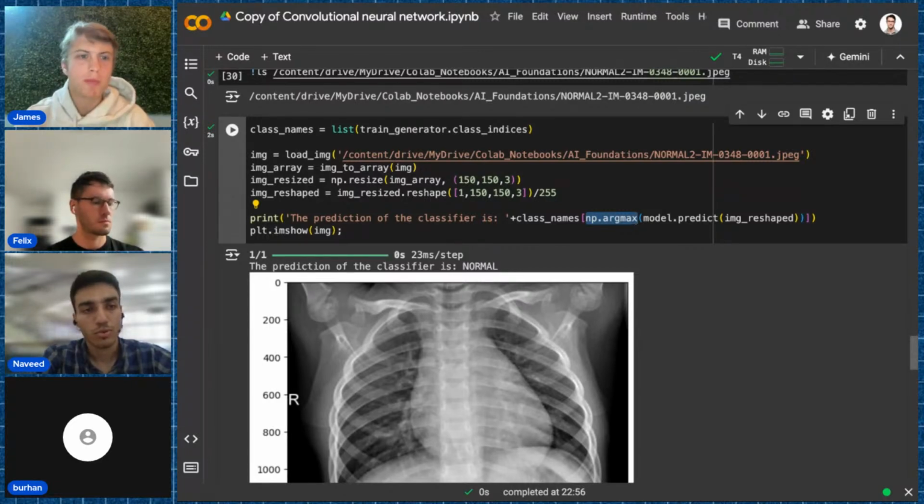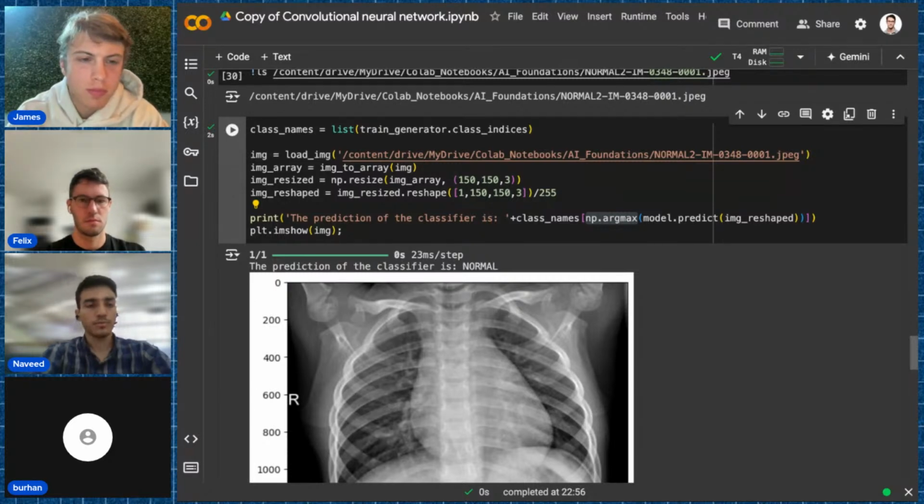Of course, we still have 1,000 images in the normal class, so it should be able to recognize that class as well. That we can put on the model itself. If we make the model more sophisticated, it would be better at recognizing the normal class as well. But at least some of the explanation comes from the skewed dataset.